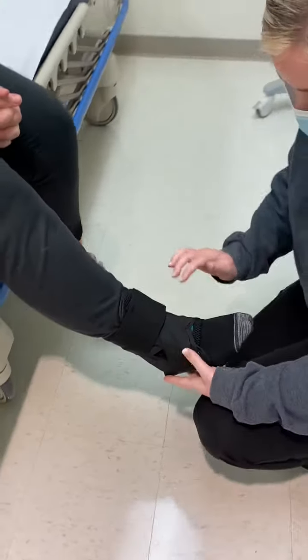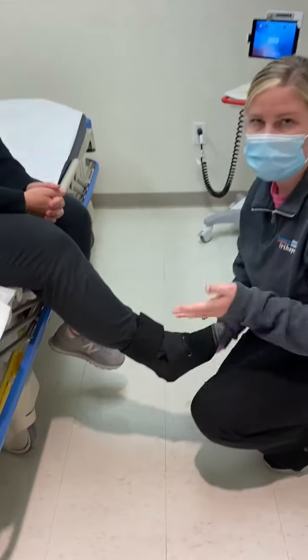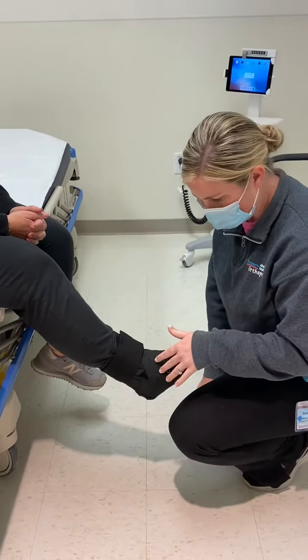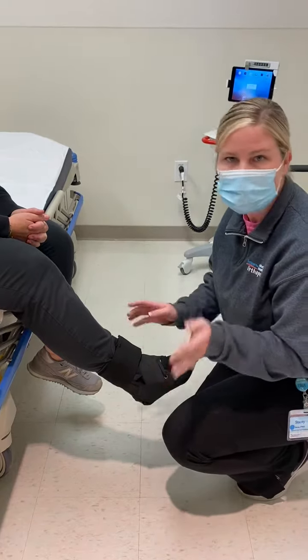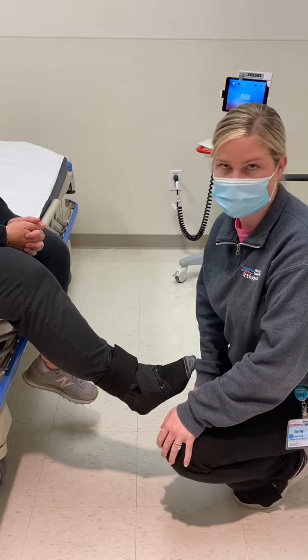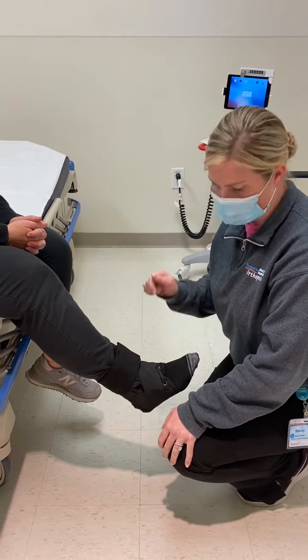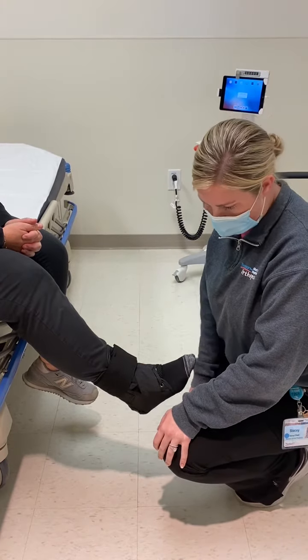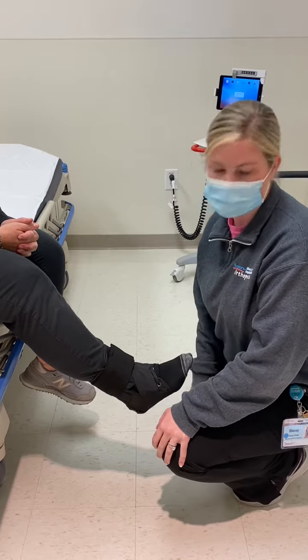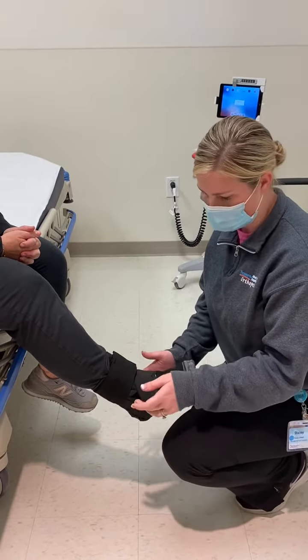These braces come in several sizes. You can use the patient's shoe size to give you an idea, but it's better to bring in two sizes — for example, if they're a size 7, bring in a small and a medium, because everyone's foot varies. They would also put their sneaker on top of the brace, so the order is: sock, brace, sneaker. They can machine wash the brace or spot wash it, then line dry.